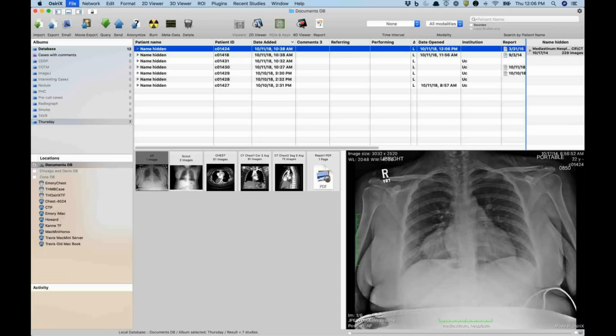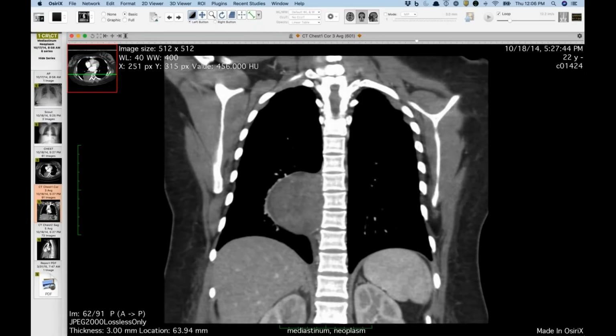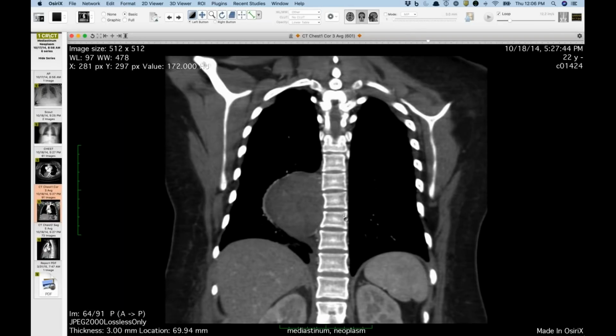Hey, question for you guys. When you see a paraspinal mass, do you typically do a CT, or do you sometimes just go right to MR given the high likelihood it's going to be neurogenic? That's a good question. I think we just generally go to CT just because it's quicker, faster, and this was all done outside. For sure. And they're going to take it out anyway.